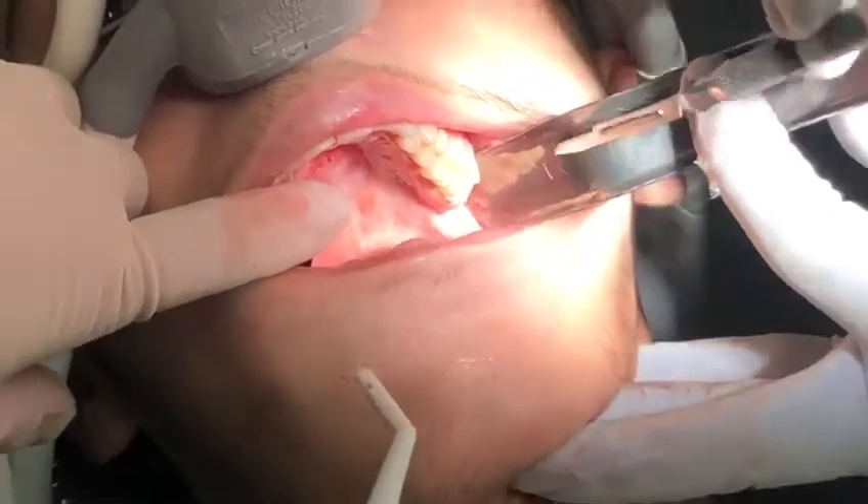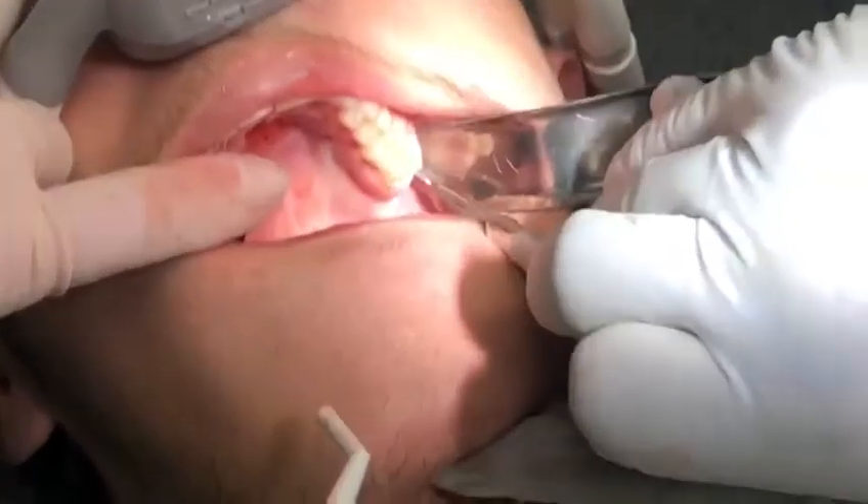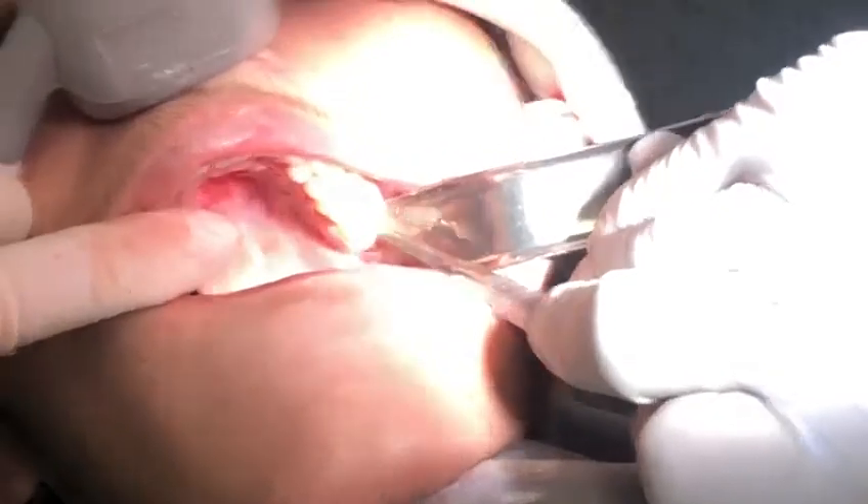1st molar, 2nd, and 3rd — we can start with stuff. Let's see right there, a little bit of 45 degrees, kind of, right there.